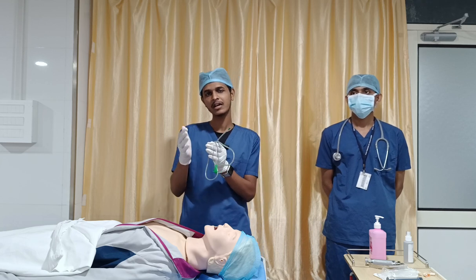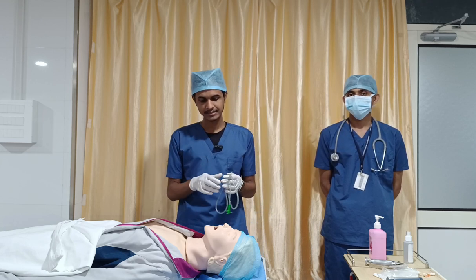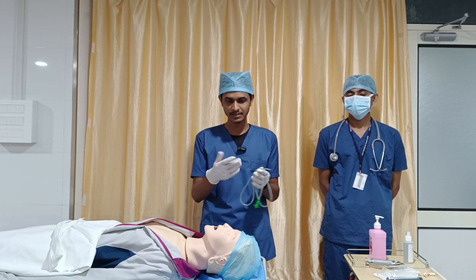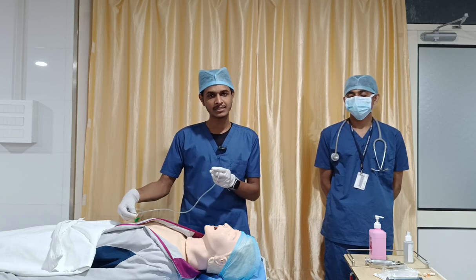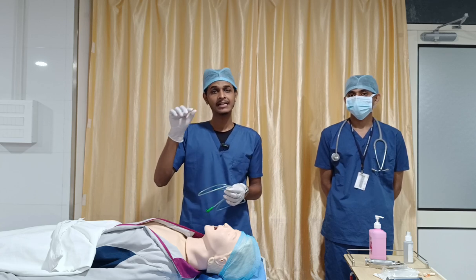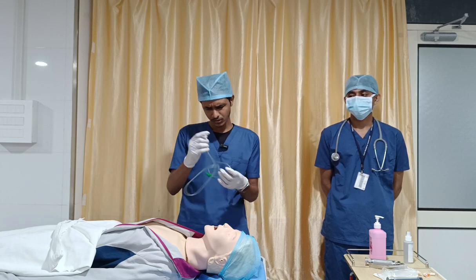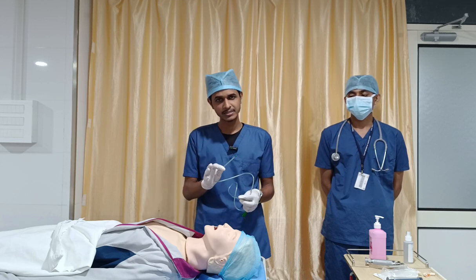So that is what one of the proof studies we have in our clinical side, in our evidence base. So that's why here I got 60 centimeters by measuring up to the xiphisternum. So I am adding plus 10, that is coming to 70 centimeters. So before inserting, we already positioned the person.